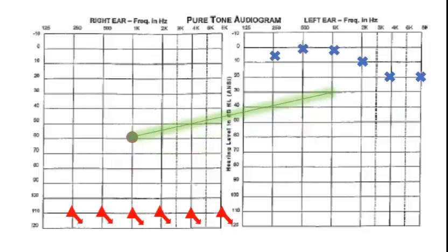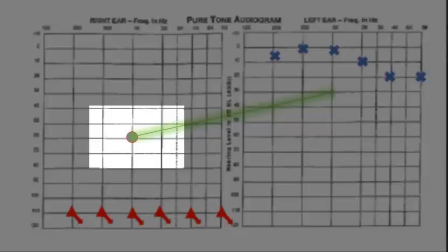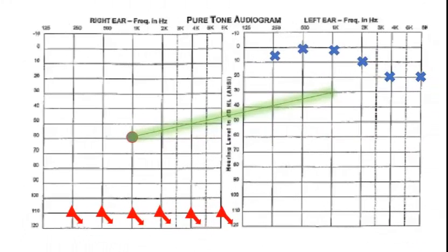As we know, it's possible during air conduction testing that even if you have an ear with no residual hearing, we can deliver a test signal to that ear with air conduction and the person will respond. The problem is that they're not responding by hearing the signal in the test ear. It can cross to the opposite unintended ear, where they might be able to hear it. This is known as a shadow response. So when we see this situation, we know that masking is required.